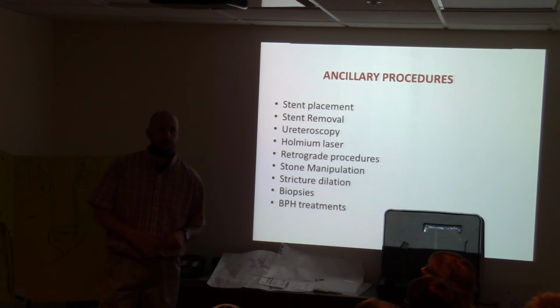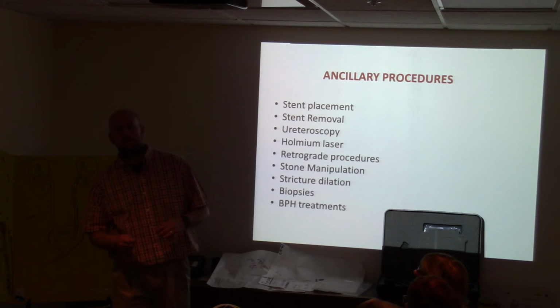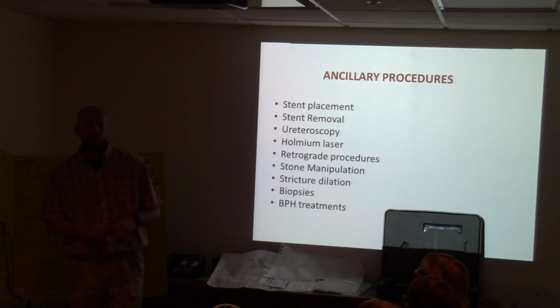And you'll see ureteroscopies, every holmium case, almost every holmium case, 80% of them are probably ureteroscopies. Okay. They'll do some holmium cases for bladder stones where there's a huge stone in your bladder, and they'll break that stone up with a holmium laser. Okay. But we don't carry ureteroscopes. For the mobile?